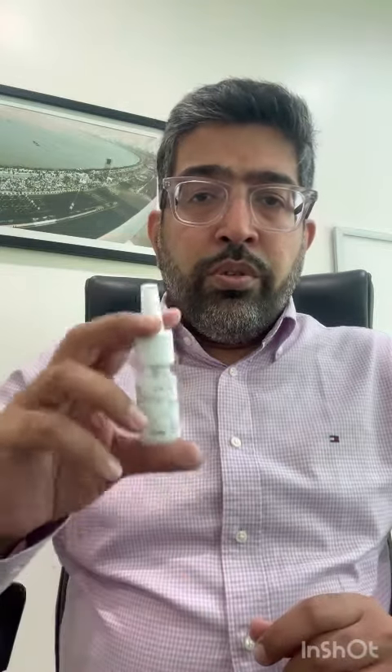Hi, today I am going to show you how to use a nasal steroid spray correctly. It is usually a bottle that is shaped like this.